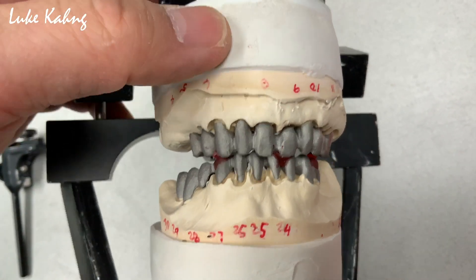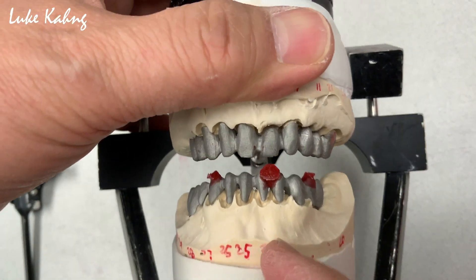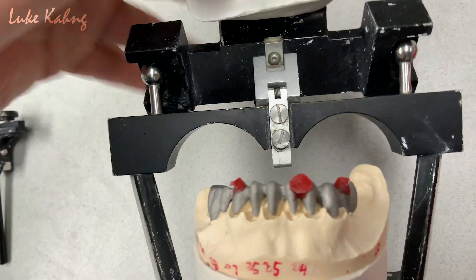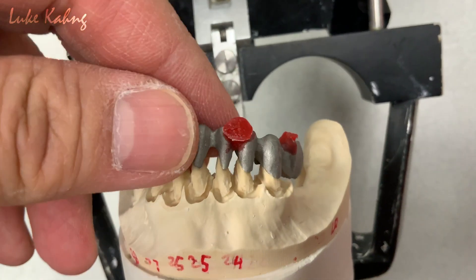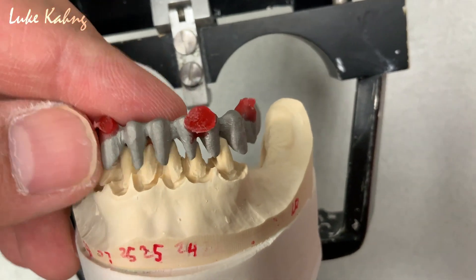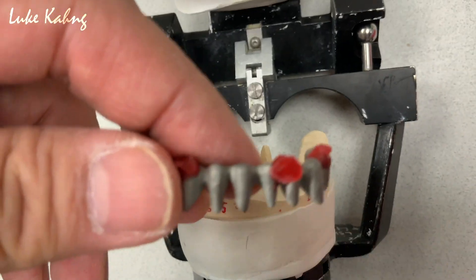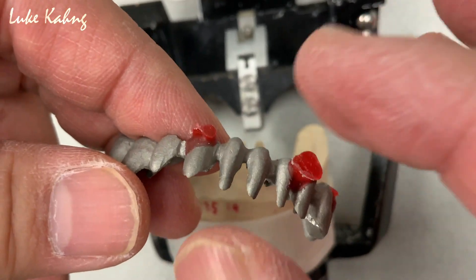Usually, a full mouth case is all the time. So we give them a resin pattern — I hope that one is good. So when the doctor tries it in the patient's mouth, they can make the stop. If it's good, awesome — take the bite. But if it's not good, just like what we did, you can do another pattern and then take a good bite.